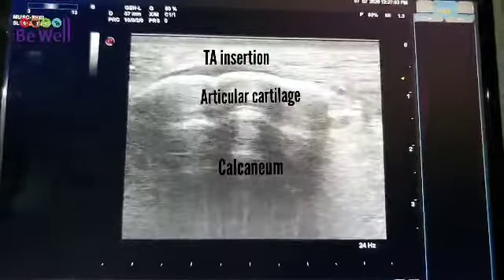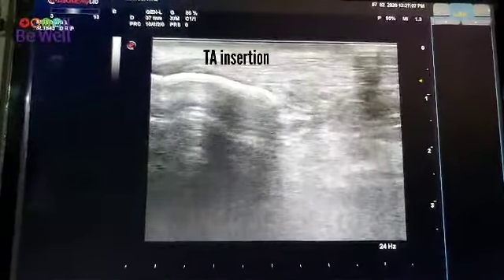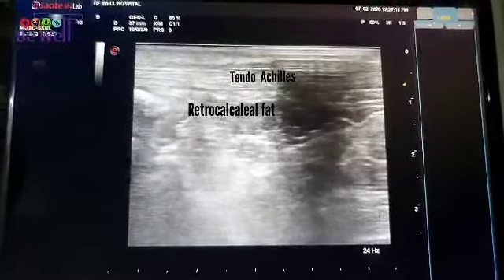As I move above, you can see the tendo Achilles has a bright, shiny, fibrillar structure just below the subcutaneous tissue.